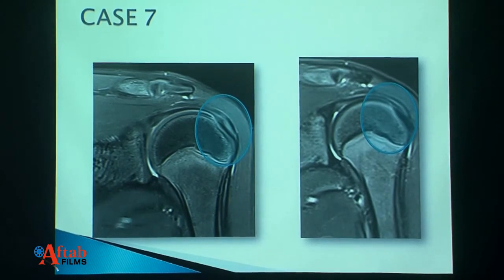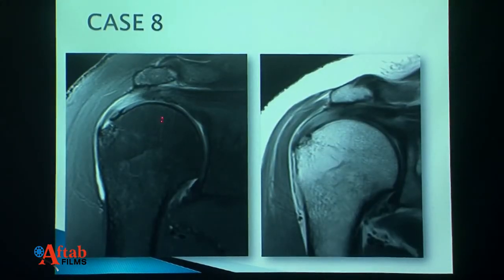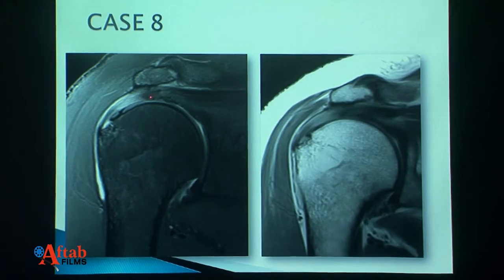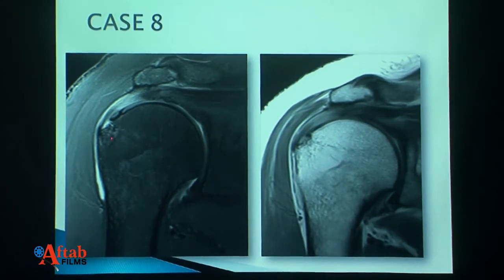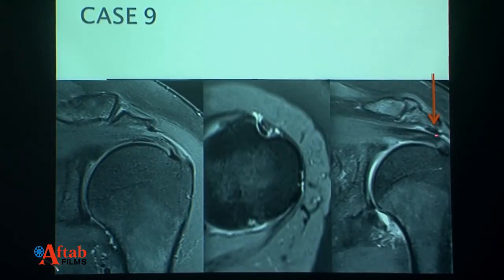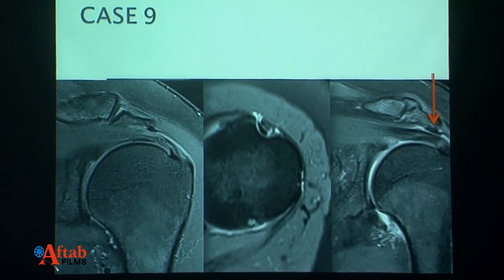In this case you can hardly see any rotator cuff tendon — it is completely edematous and filled with fluid right up to the footprint. There is laxity at the musculotendinous junction and some retraction, making this almost a full thickness tear. The bursa is seen extending beyond the greater tuberosity anteriorly, posteriorly, and laterally, with fluid tracking right up to the proximal humerus. There is also a thickened coracoacromial ligament, which can contribute to impingement and can be picked up on dynamic ultrasound.